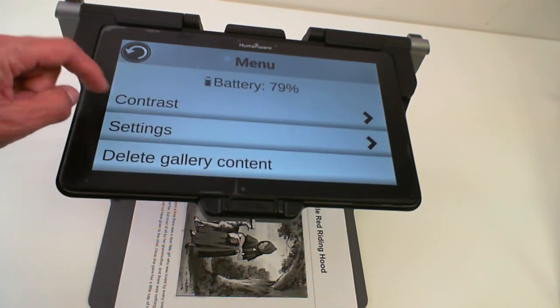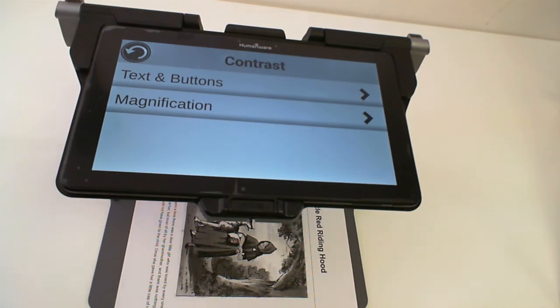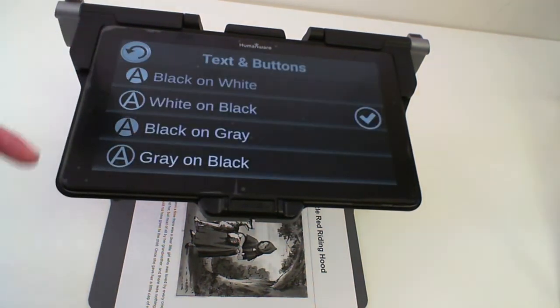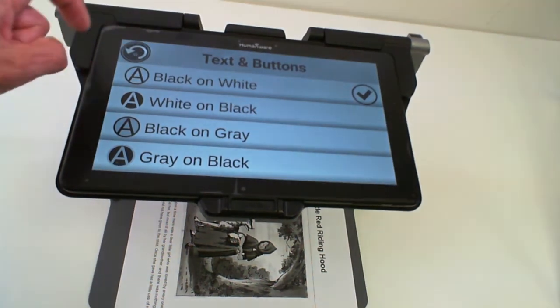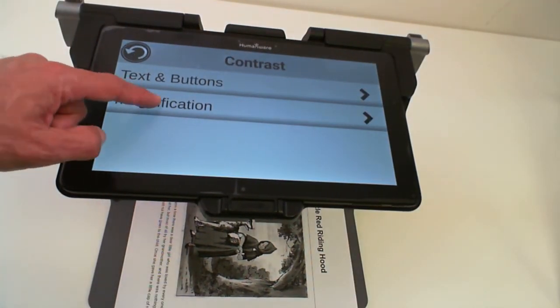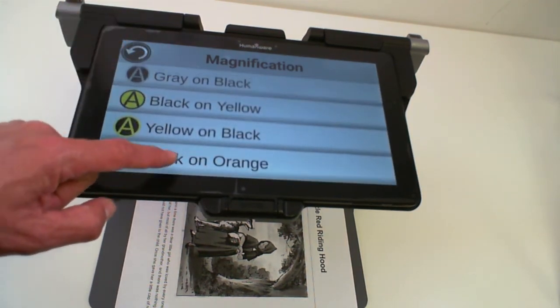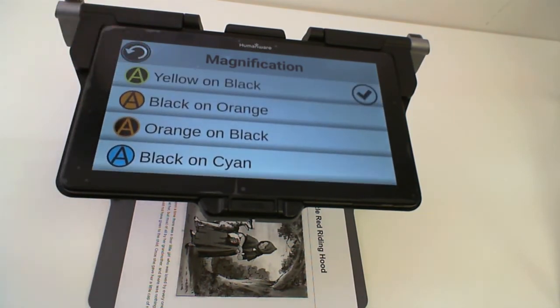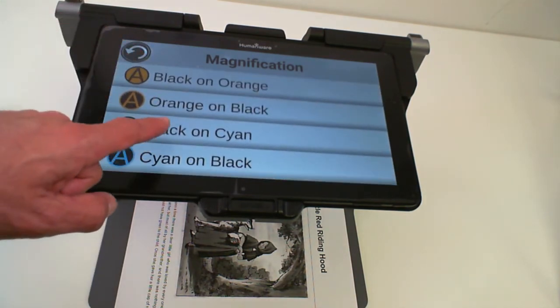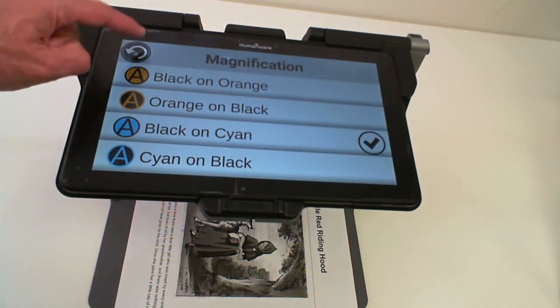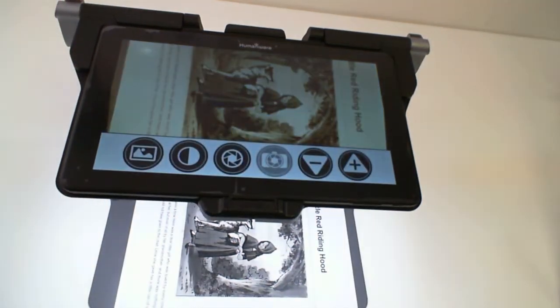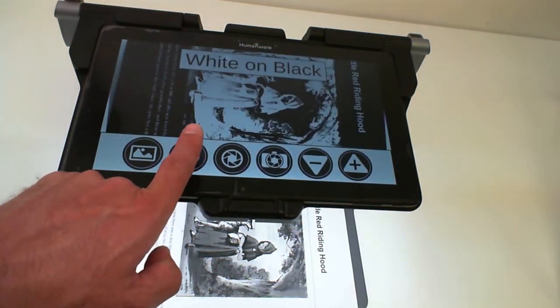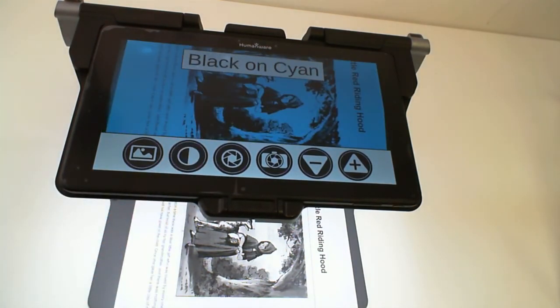The one I'm interested in right now is the contrast option. I can change the contrast on my text and button, and by doing that I will change my interface. I can also change my magnification contrast, and I can select several options that I want. Let's say I want to have yellow and black, and black on cyan. I go back to my magnifier and press my contrast button — you will see that those two colors will be added to my loop.